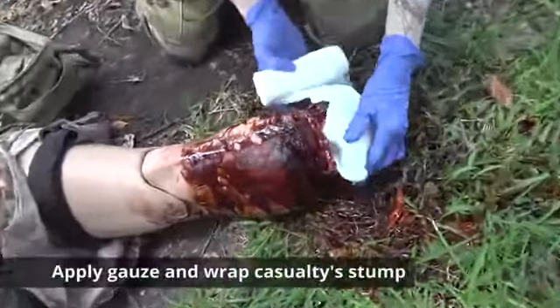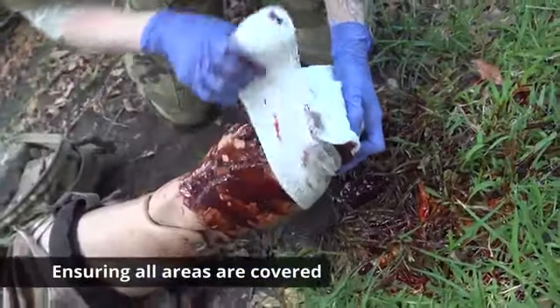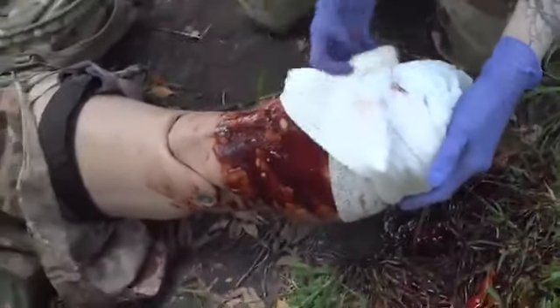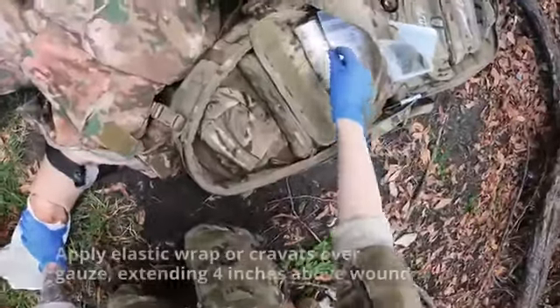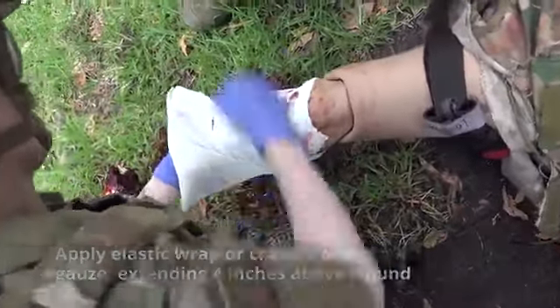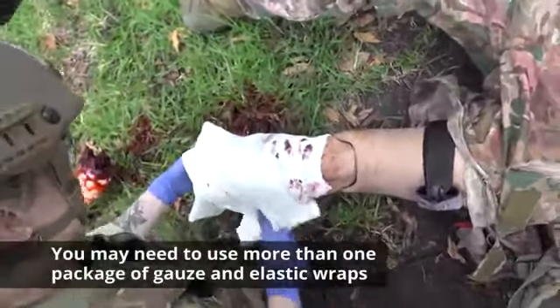Apply gauze or other dressing materials and wrap the casualty's stump, ensuring all areas are covered. Apply elastic wrap or cravats over the gauze, extending four inches above the wound. You may need to use more than one package of gauze and elastic wraps.